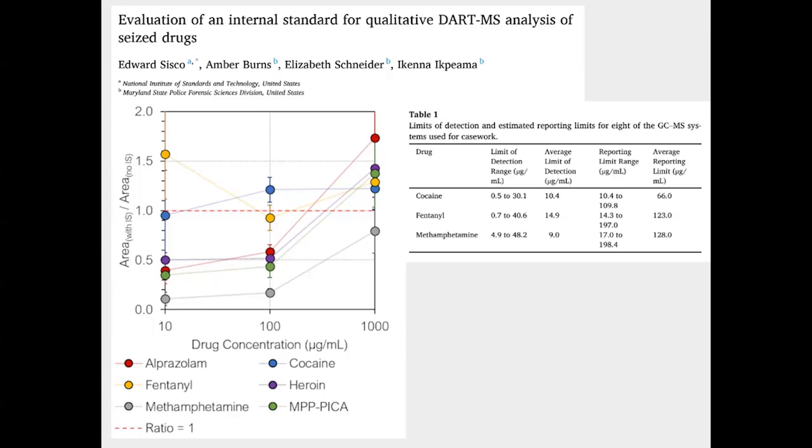And when you use the internal standard at the concentration we set, the area count of the internal standard is above 1,000,000. So when you threshold to 5% of that, you are not picking up the drugs that would be at a background level. So we did find that it would help us with data integrity, not have a result in our search list that was not from our sample. Next slide.